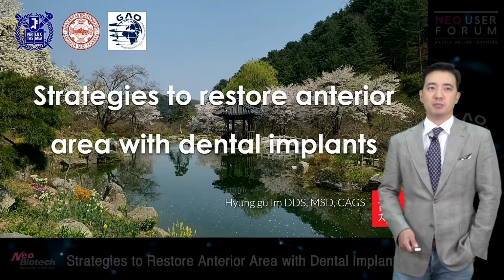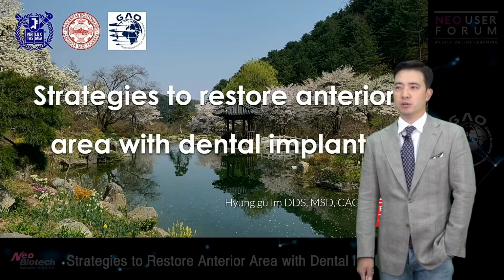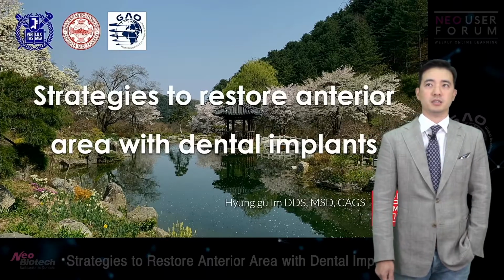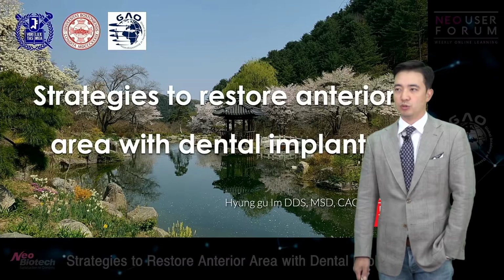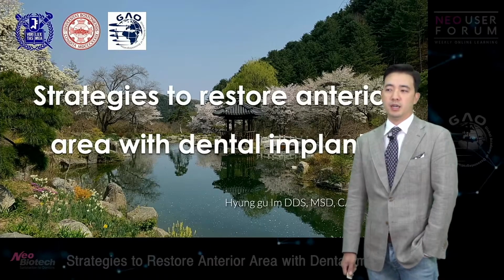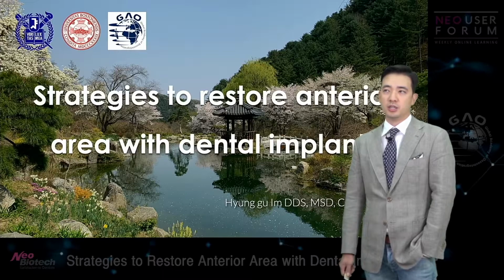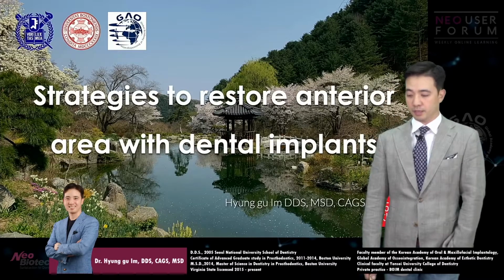So last time we talked about minimally invasive implant placement, and I just wanted to bring up the issue of placing implants in other cases in the maxillary anterior area, because of course we always want to do minimally invasive surgeries, but that is not always the case when the patient's condition doesn't allow that kind of implant placement.